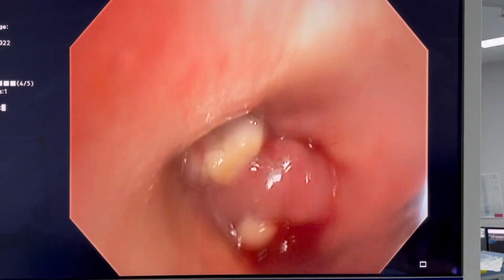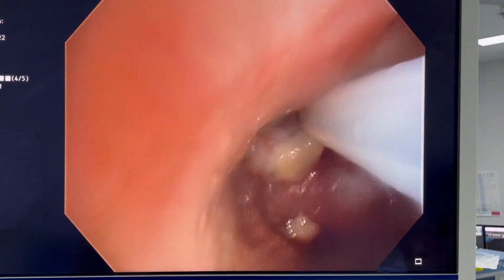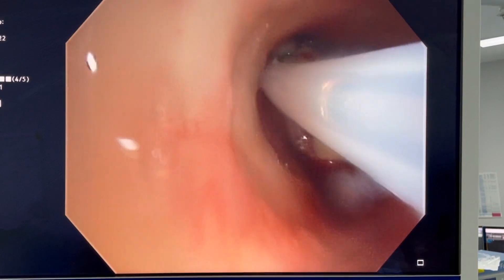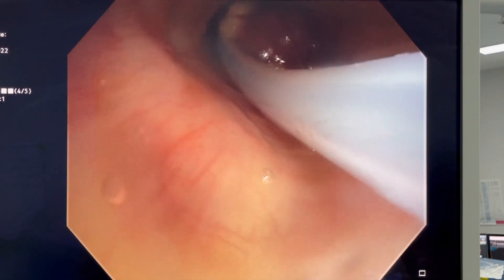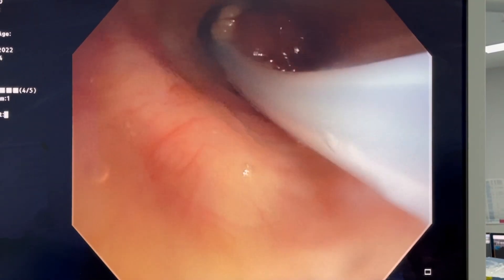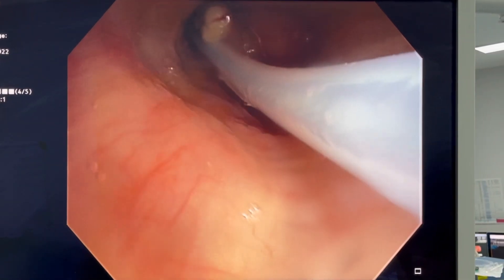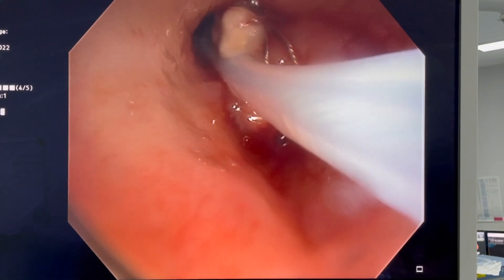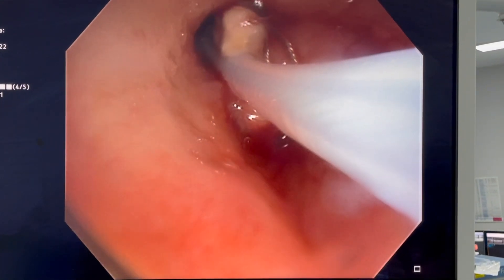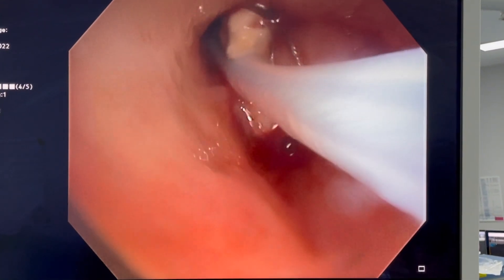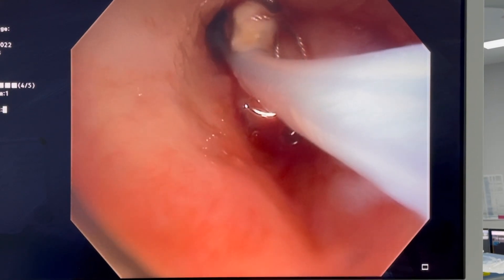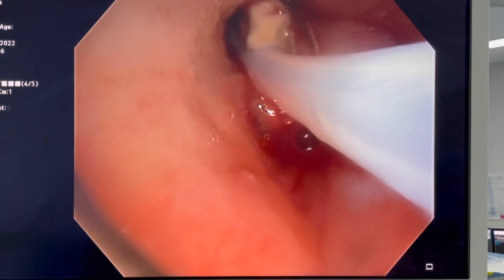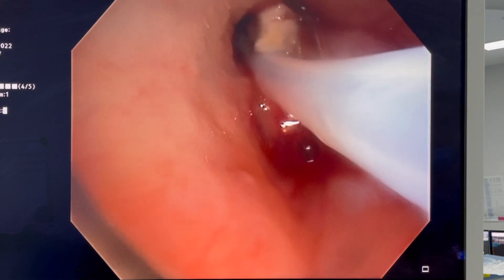You can see there's just a little bit of bleeding there at the moment as I try and get that loop around it to be able to resect it off the airway wall. The loop is around now — I'm just applying an electrical current and that should be able to cut through it.